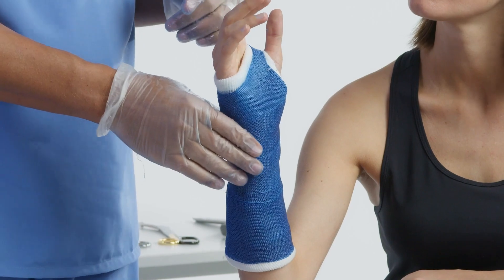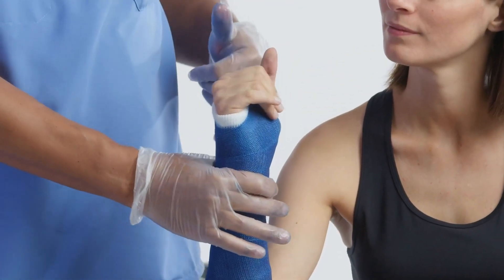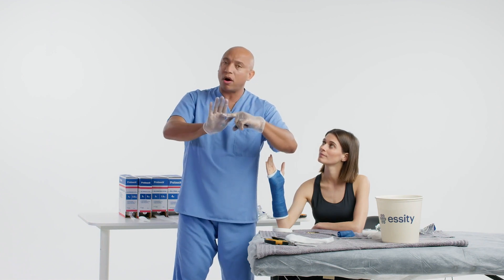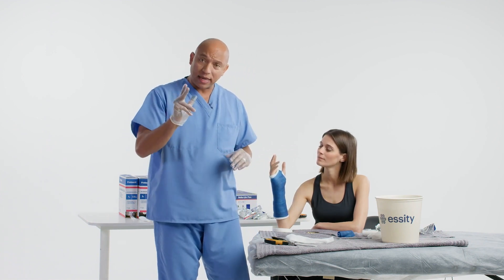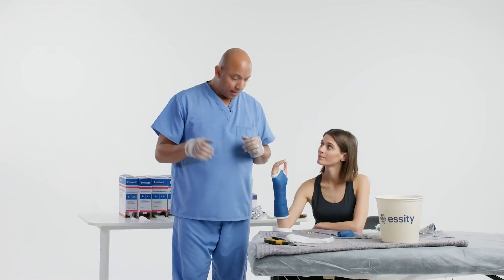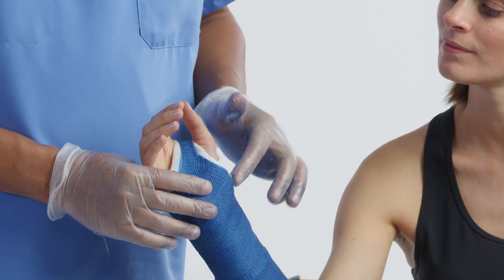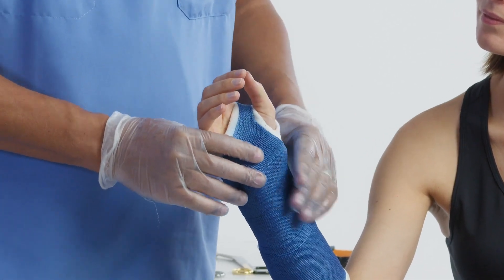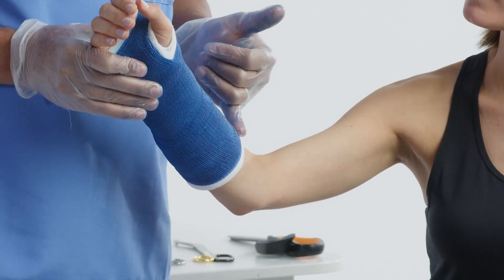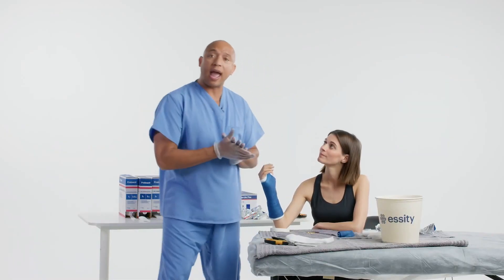What we just did is a short arm cast using DeltaLite Plus. Make sure we notice: number one, that we have full range of motion of the fingers — the cast is angled, which allows for good range of motion. If your cast is straight across, you're inhibiting the fourth and fifth finger movement and opposition. We made it nicely contoured around the thumb without sharp edges, plus we got good range of motion for the thumb. We terminate the cast where the patient's at 90 degrees and we have a nice padded edge — we don't want it hard or sharp at the edge. That is the short arm cast using DeltaLite Plus.